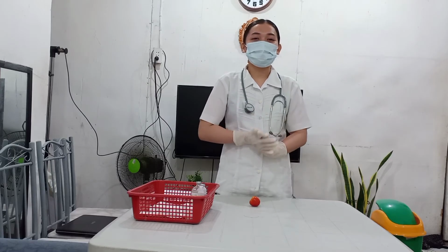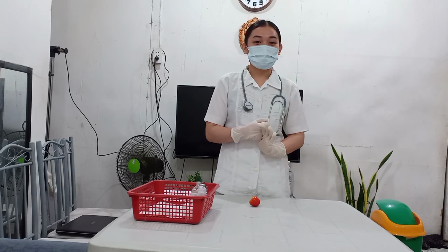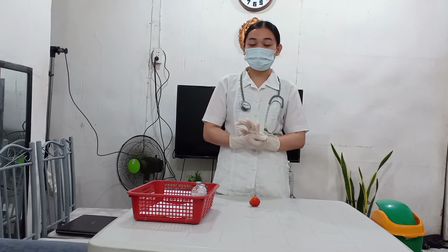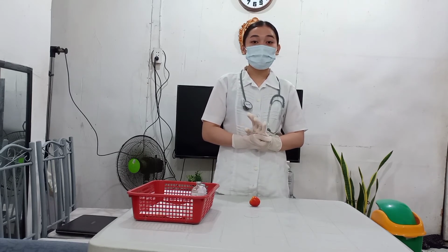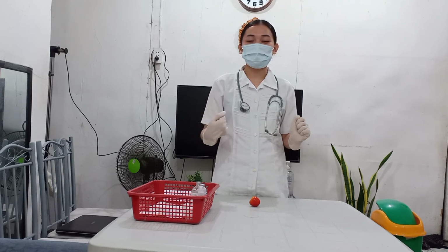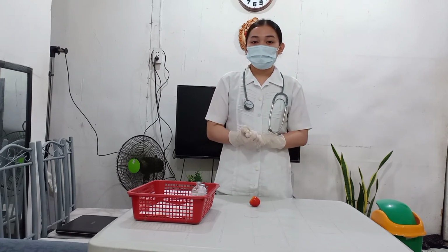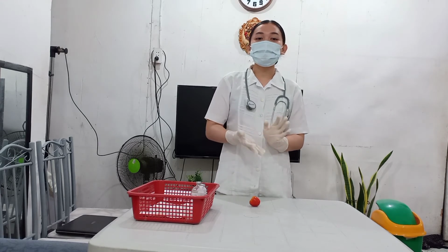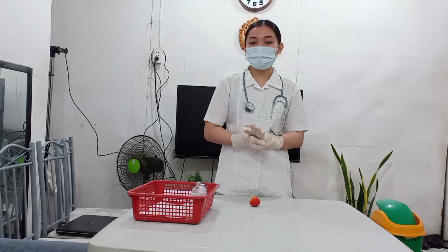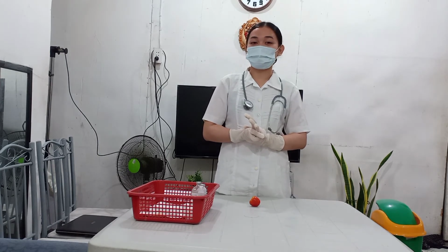Now I will proceed with administering a subcutaneous injection. The first step is to perform hand hygiene and observe the appropriate infection control procedures. This is to prevent contamination and possible transmission of microorganisms. Since I've already done washing my hands and donning my gloves, I will now proceed to the second step, which is to prepare the medication from the vial or ampule for drug withdrawal, because organization of necessary items for the procedure facilitates accurate skill performance.